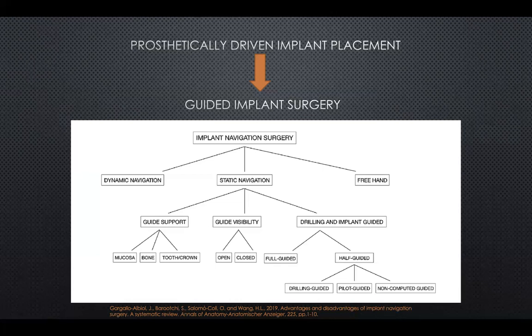Once it's designed, you cannot change it. And the other type of implant navigation surgery that came to the surface lately is called dynamic navigation. We're going to talk about it later as well. It gives you instant feedback, and it's not static navigation. It's dynamic. It's more interactive.